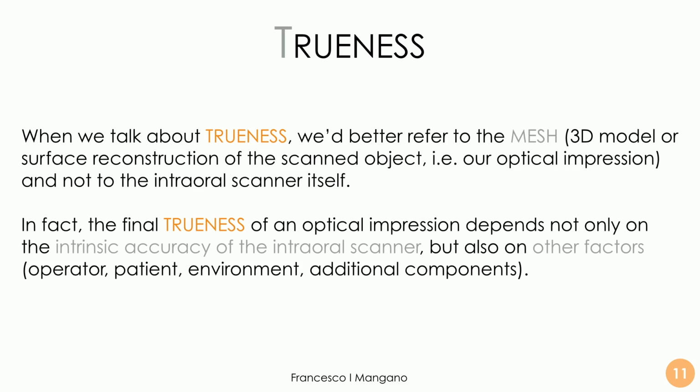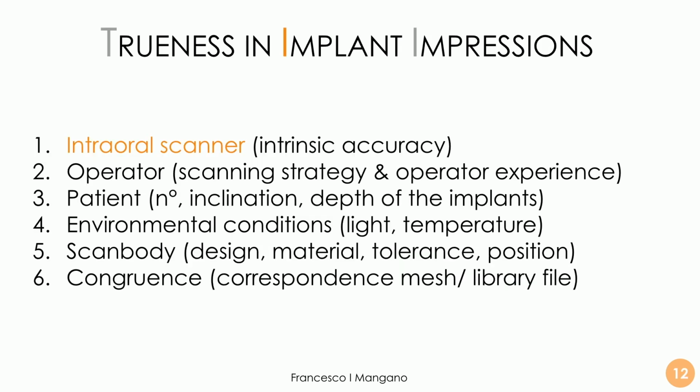Then the environment, the light conditions, and there are also some additional components, for example in implant prosthodontics, the scan body. So everything together contributes to the final trueness. So it's much better to define trueness as an element of the mesh itself and not of the scanner, even if different scanners have different trueness, of course.